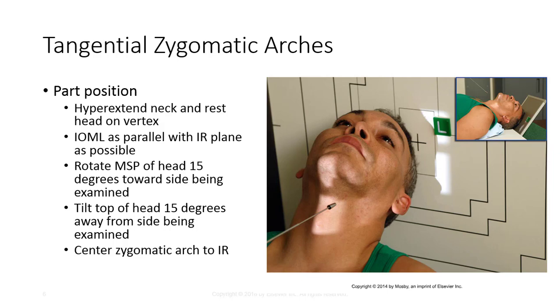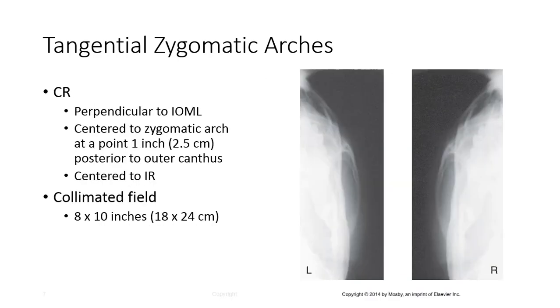Next, tilt the top of the head 15 degrees away from the side being examined. This motion frees the base of the arch from superimposition of other cranial bones. Center the zygomatic arch to the IR. Place the CR perpendicular to the IOML and center to the zygomatic arch at a point 1 inch posterior to the outer canthus of the affected side. Center to the IR with a collimated field of 8 by 10 inches. This view should be performed bilaterally with opposing rotation and tilt for each side.